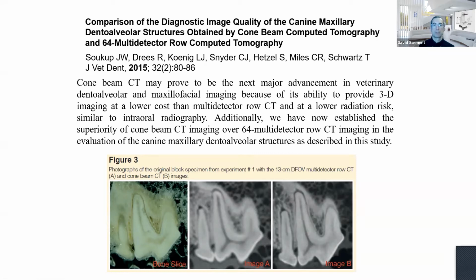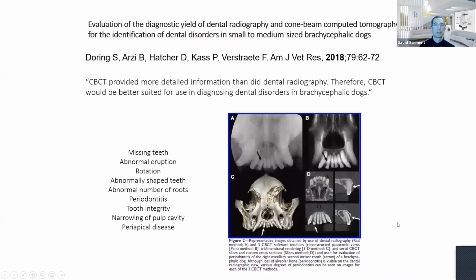In that specific situation. And I'm specific with the wording because conventional CT, of course, does miracles for all sorts of other situations where cone beam CT is not a good solution. One of them is speed. So if there is motion, like hearts and lungs, cone beam CT is not a good modality because it rotates way too slowly for imaging a heart, for instance. But for anatomy that's stable, where a few seconds are not critical to the image quality, and where the bone window is the most important, then cone beam CT has the particularity of giving you a good resolution. And we'll look at that a couple more times.